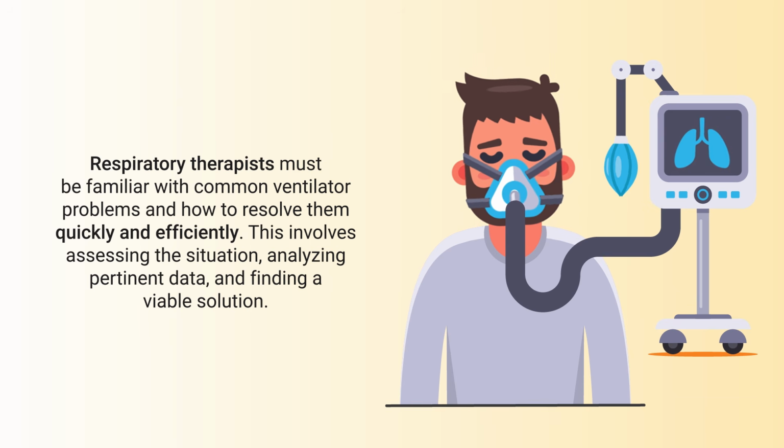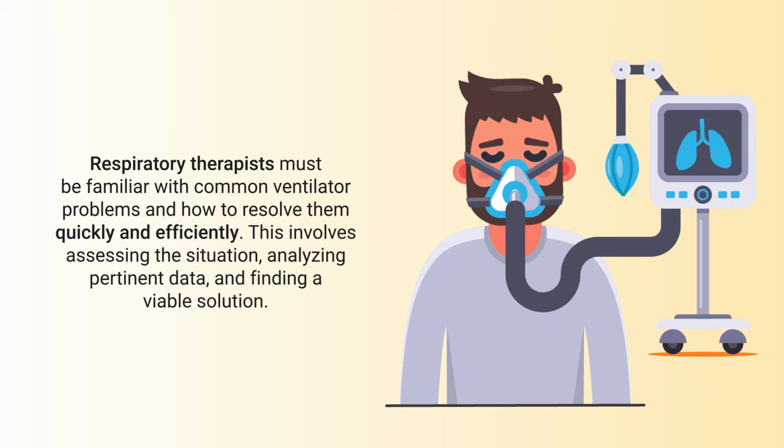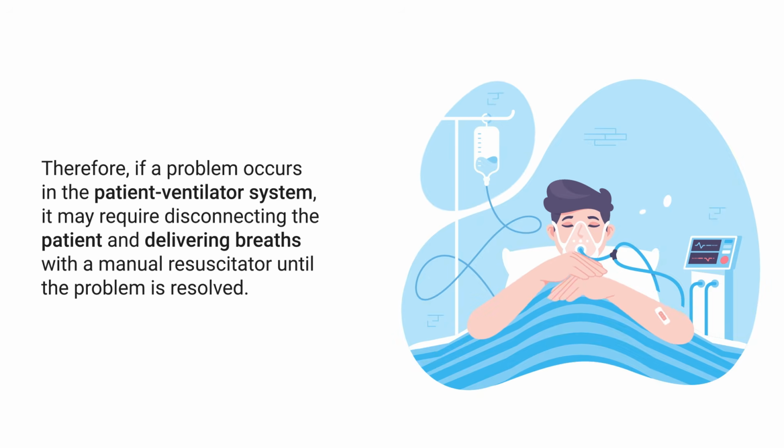This involves assessing the situation, analyzing the pertinent data, and finding a viable solution, which means that you must always remember the primary goal is to protect the patient by ensuring that they are receiving adequate ventilation and oxygenation. Therefore, if a problem occurs in the patient ventilator system, it may require disconnecting the patient and delivering breaths with a manual resuscitator until the problem is resolved.